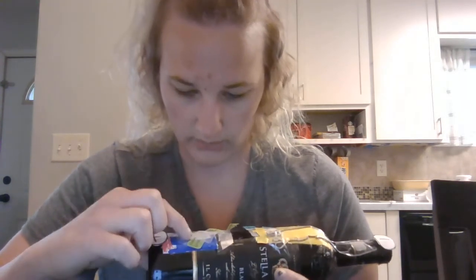And then we move over here to the anode side, which is the positive side, which is why I have a plus sign. It is a primary source of directing heat out of the tube. And then again, tungsten is the main material of choice. This area here is the target area of the anode. This is where X-ray photons are made. The rotating anode increases the target area, and it has a much greater heat loading capacity than stationary anodes.